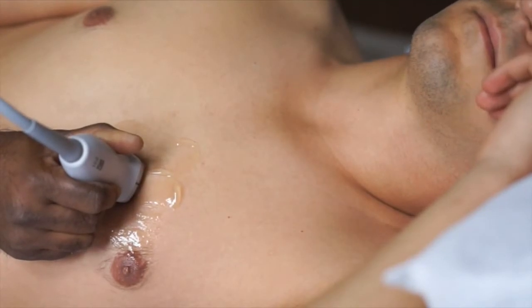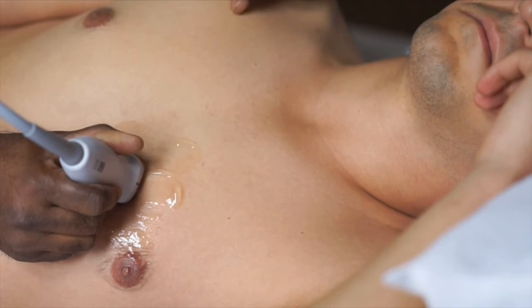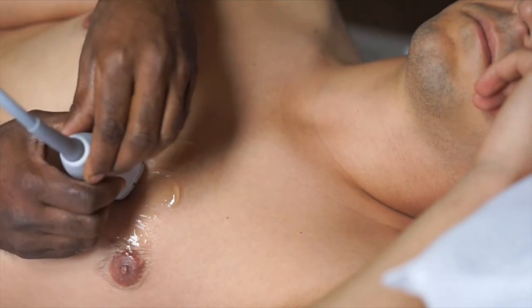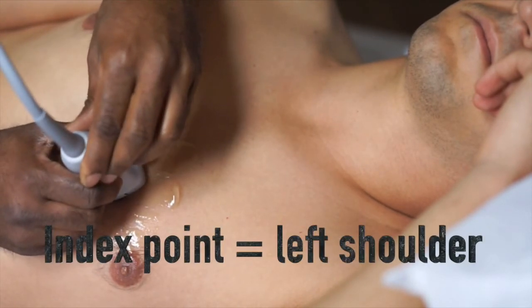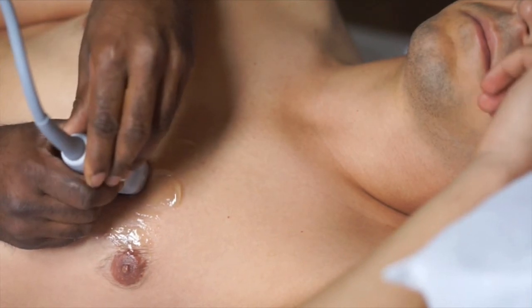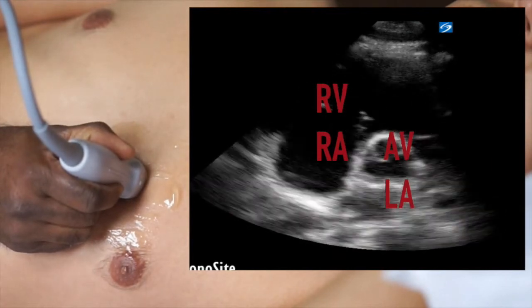The second view in the parasternal views is the parasternal short axis view. To get this view from the PLAX view, you rotate the probe clockwise 90 degrees towards the patient's left shoulder. You traditionally start at the base of the heart at the level of the aortic valve.